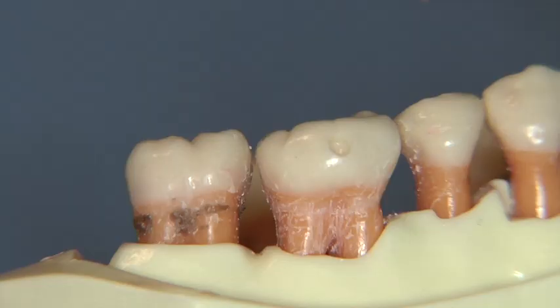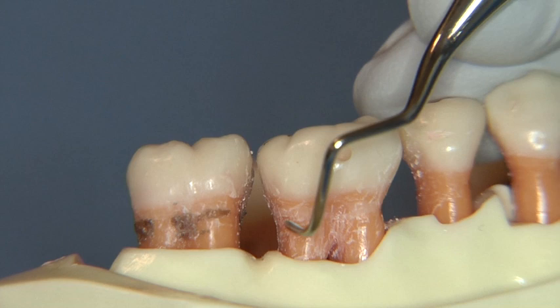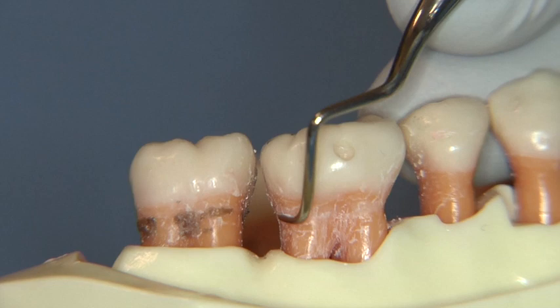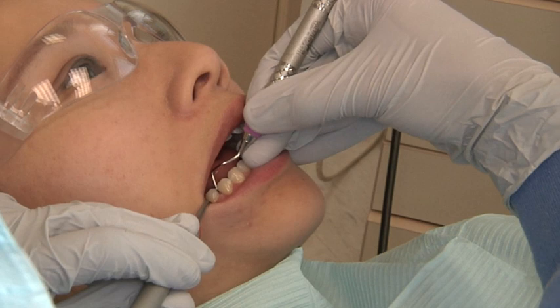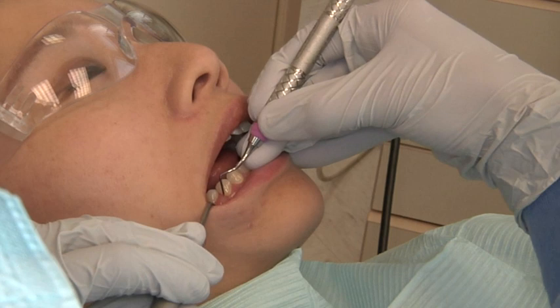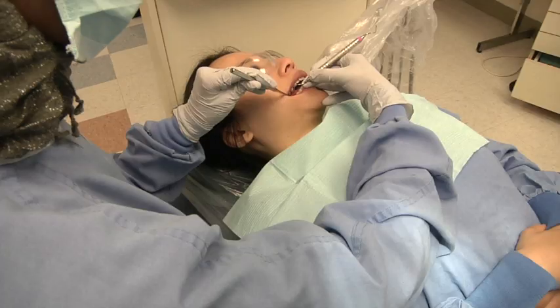To avoid excessive removal of cementum from the root surface during the root debridement stroke, use a lighter amount of lateral pressure with longer strokes that cover the root surface. Maintain instrument adaptation during working strokes by rolling the instrument handle slightly between the index finger and thumb so that the lower third of the blade remains adapted to the tooth surface as you work around the distal line angle and into the distal interproximal surface.